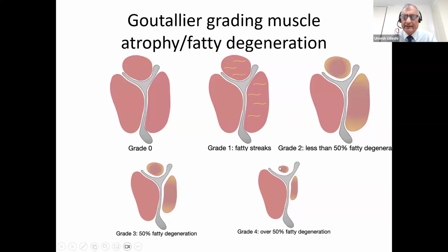If it's a fatty shriveled little thing, the rehab required is too much for elderly frail patients to achieve, and so they'll get no benefit at all from repairing that tendon. So if there's fatty degeneration of the rotator cuff muscles, there's no point doing surgical repair.